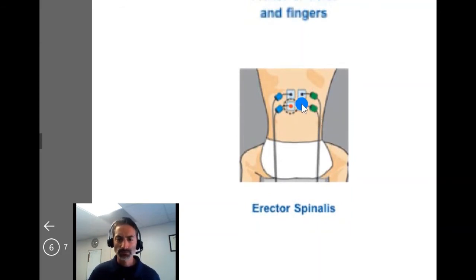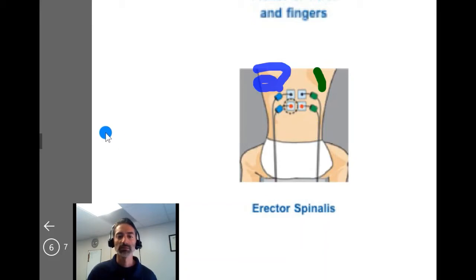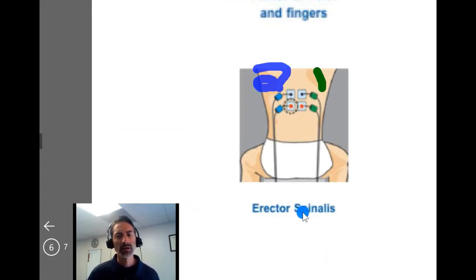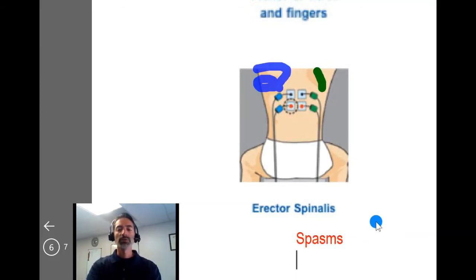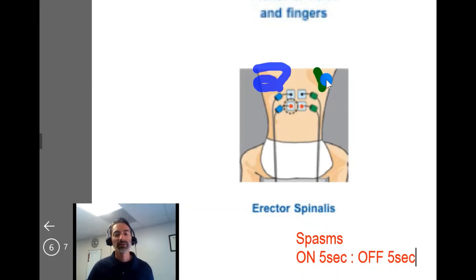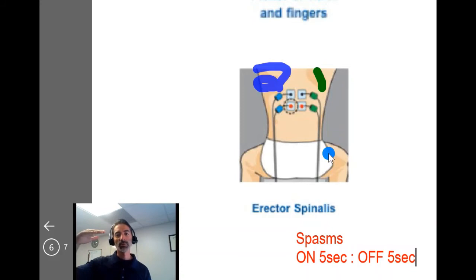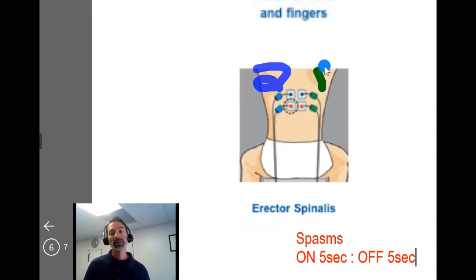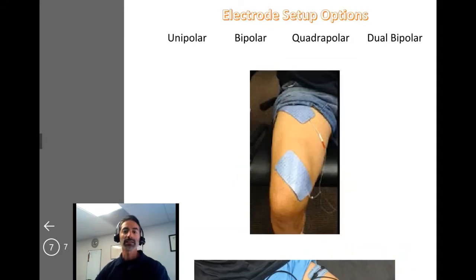For another example, you have channel one here and channel two there — that is also a dual bipolar setup. You might set this up when someone has paraspinal spasms, using an on-time of five seconds and an off-time of five seconds to fatigue those muscles. They may be hypertonic or facilitated and you want to inhibit them and down-regulate their spasm and spasticity. You'd set up channel one and channel two independently. That's an example of dual bipolar using Russian stimulation.